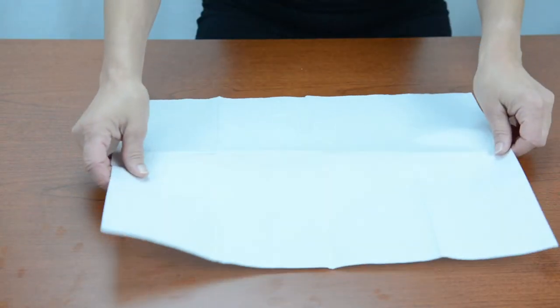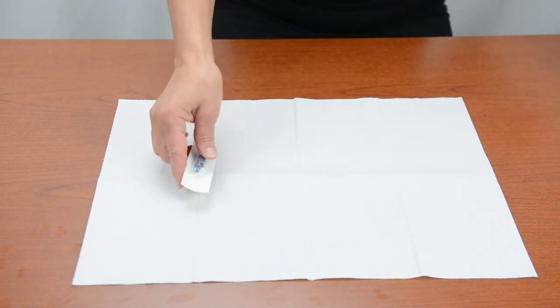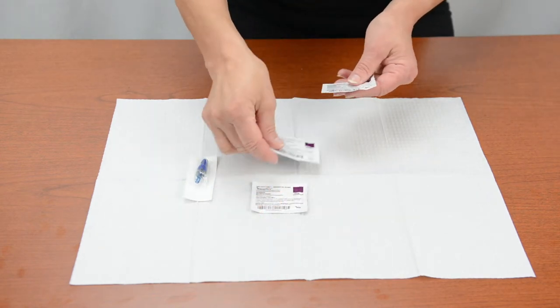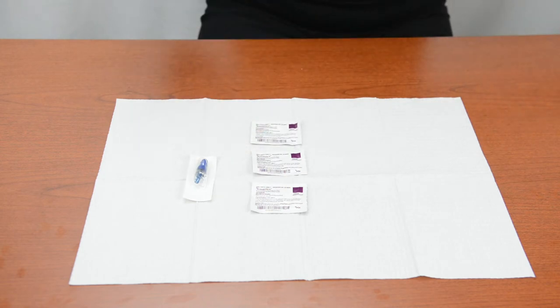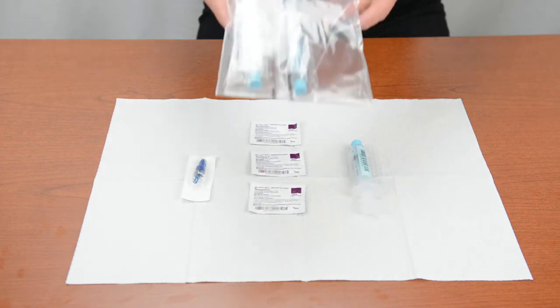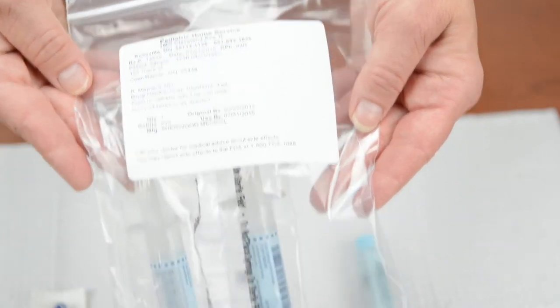Then lay down a clean paper drape or towel to create a safe zone. On your drape, place a needleless connector, three disinfecting pads, and one heparin syringe. Check the pharmacy label on the heparin syringe bag to make sure all the information on the label is correct.